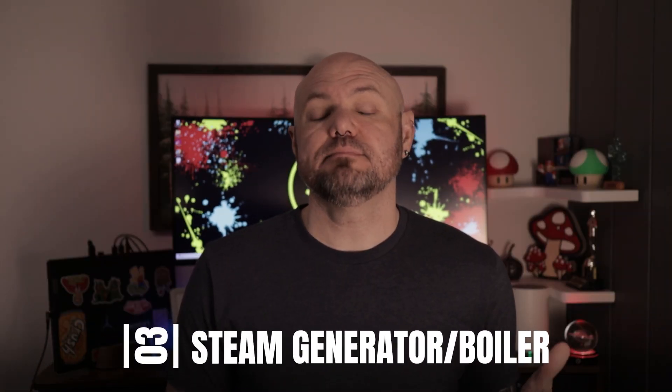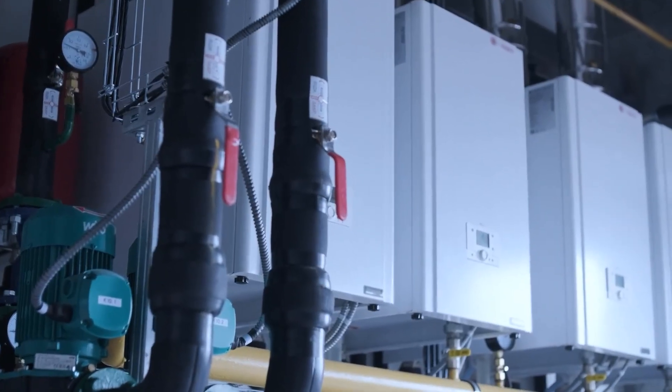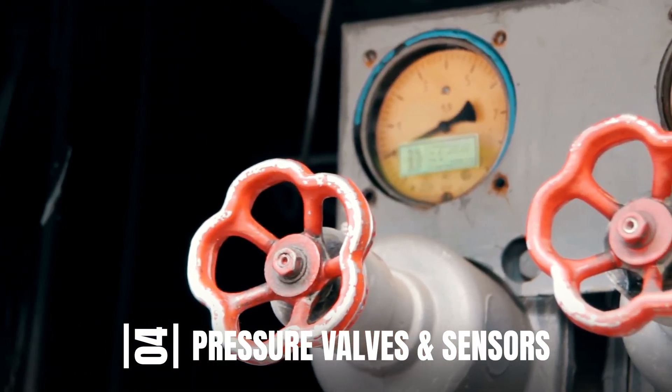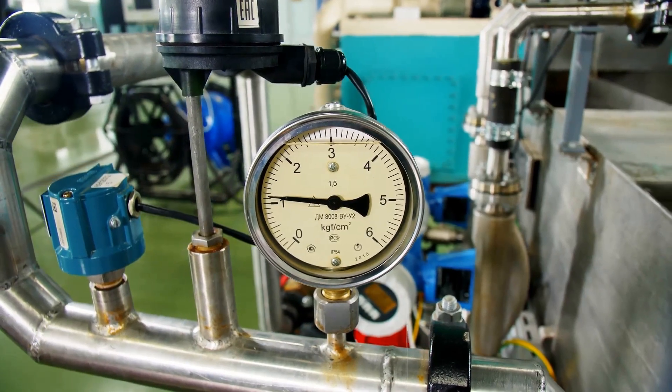Next, we have a steam generator or boiler, which produces high-pressurized steam at high temperatures. Smaller autoclaves generally produce their own steam, but for large capacity sterilizers, we need a separate machine or boiler. Next are pressure valves and sensors, which regulate temperature and pressure inside the autoclave, monitoring that pressures reach the appropriate levels for steam penetration and air evacuation.